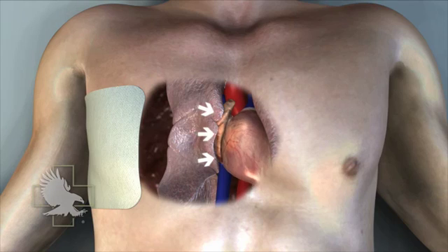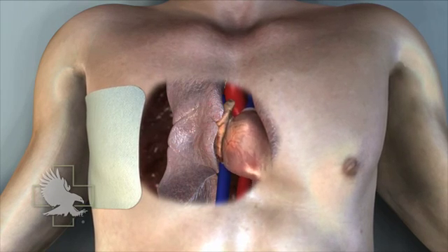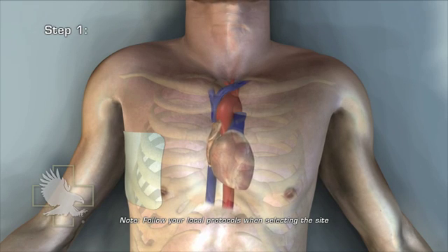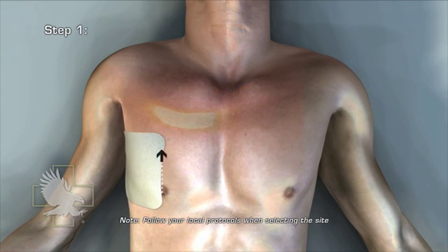The rescuer decompresses this tension pneumothorax by performing a needle thoracostomy, commonly referred to as a needle chest decompression. Step 1: Select site — affected side, second intercostal space, mid-clavicular line. For reference, you should never insert a needle closer to the center of the chest than a line drawn from the nipple straight up to the collarbone.